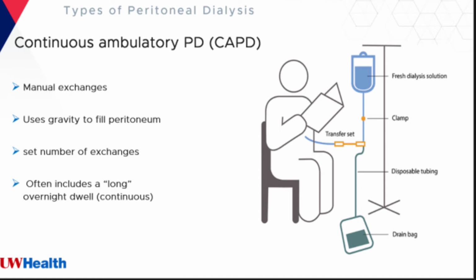Very few patients maintain this type of dialysis. It is labor intense. Most patients switch to the cycler while in the hospital. If the patient desires to perform these manual exchanges, they must be evaluated by the dialysis nurse for technique before they can be granted permission to do this. This is especially important if the patient is admitted with peritonitis.